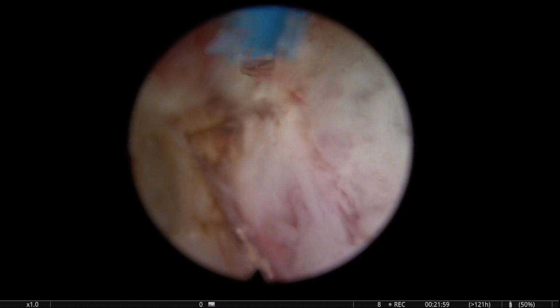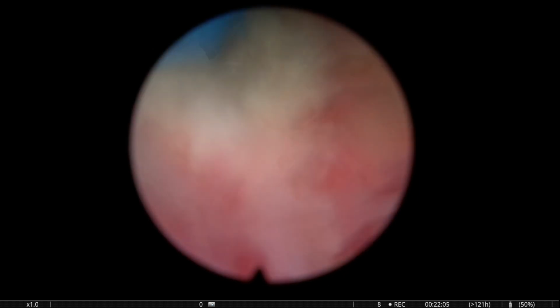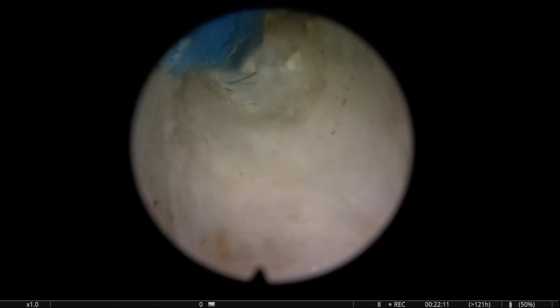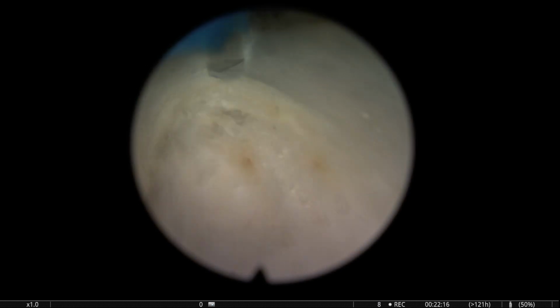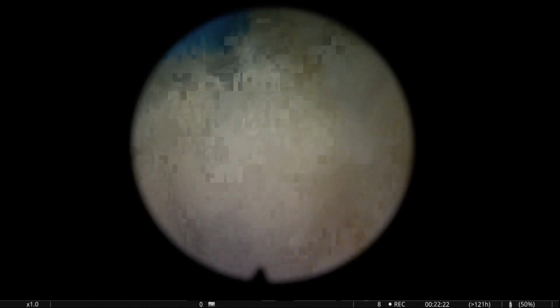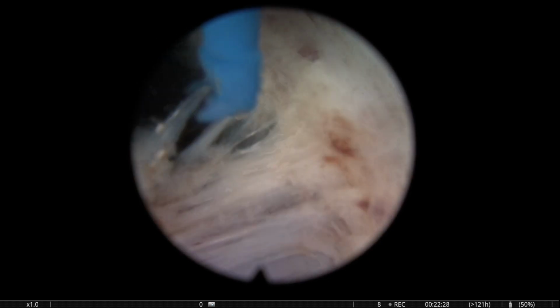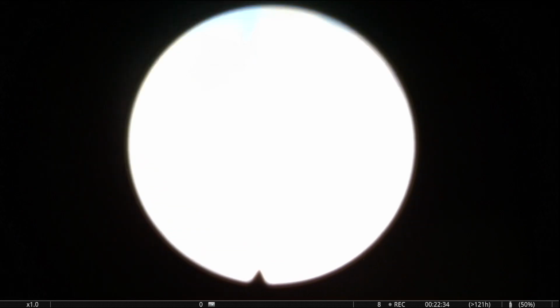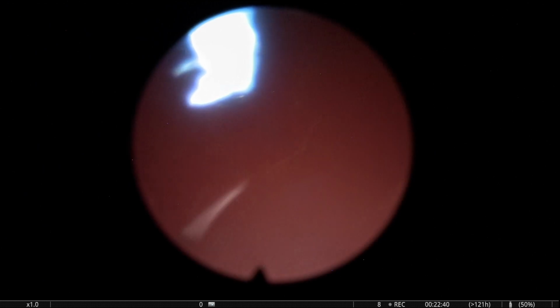The settings of the laser are defining how the energy is coming out of the fiber, but it is the surgeon who decides how the energy reaches the tissue, which means that depending on the working distance, depending on the speed of movement, and also depending on where you target the energy, you're going to have different tissue effects. And obviously, when you have a thin capsule, or when you are working closer to the bladder neck, the capsule tends to be a little bit more perpendicular to the fiber. So you have to start firing a little bit closer to the adenoma, to the edge of the adenoma.